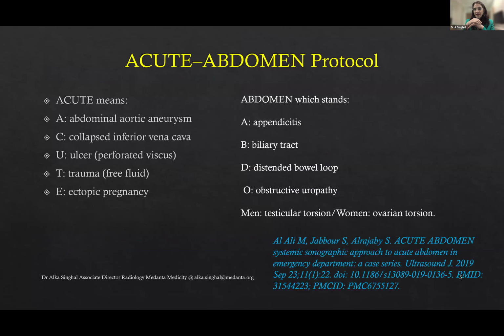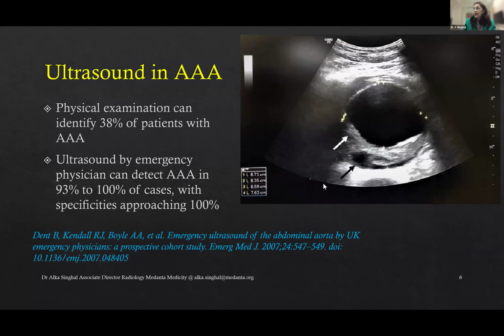And the detailed area is very intense, right? The pathology, it's like a complete clinical radiology that we have to understand and go for. Now, abdominal aortic aneurysm. Can physical examination identify it when the clinicians are examining? In very few cases, unless the patient is lean and thin, they can palpate, they can suspect, and then they can send for imaging, right? Which happens less often, right?